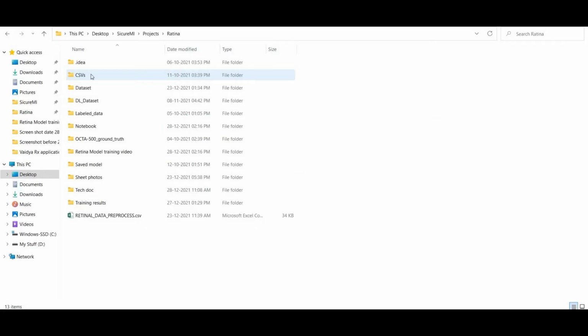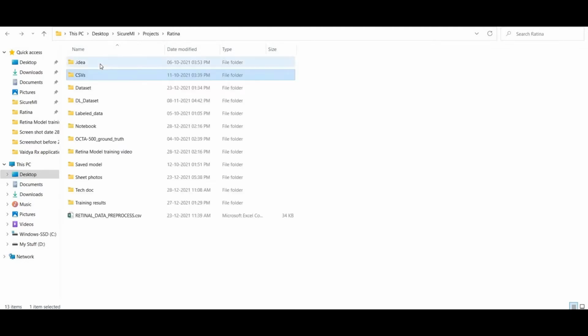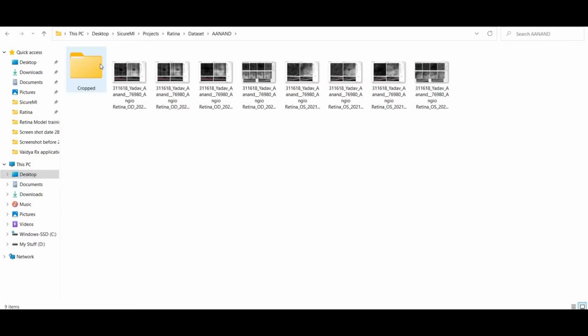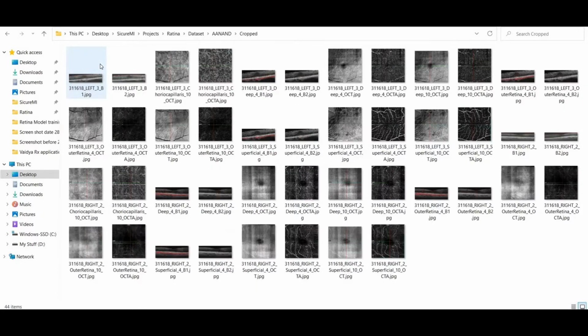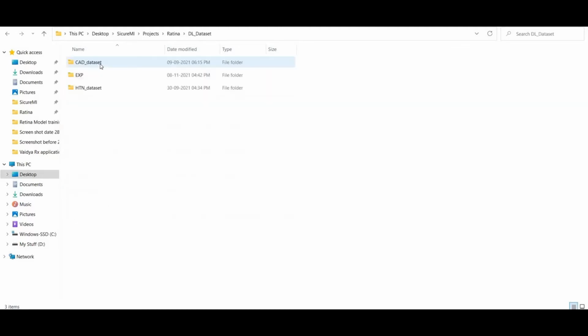Now let's understand the Retina project directory. In Retina project we have the following folders. 1. CSVs folder which contains two folders, CAD and HTN_CSVS. These folders contain the CSV files we get after pre-processing of the data from the CAD and hypertension model respectively. 2. In dataset folder we have folders of all patient data which contains the retina scans of patients. 3. DL dataset folder contains train test data for deep learning. 4. Labeled_data folder contains the data we get after the labeling process.